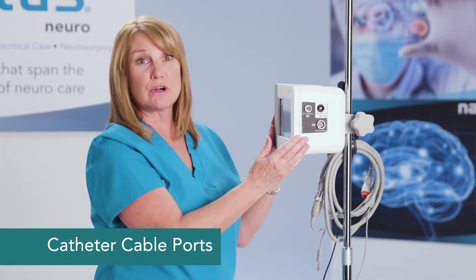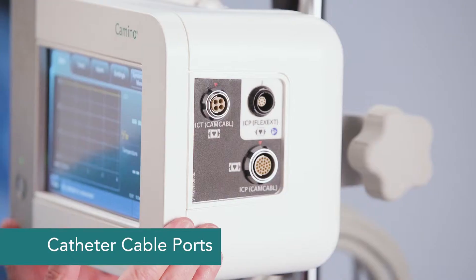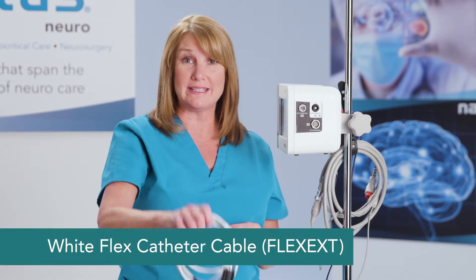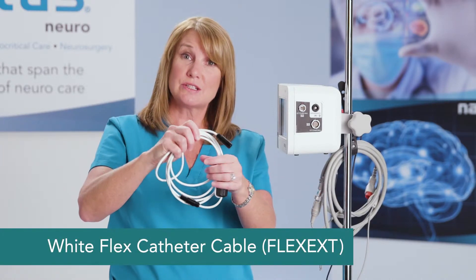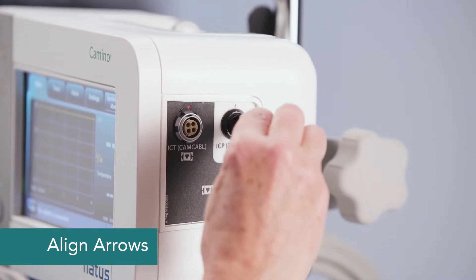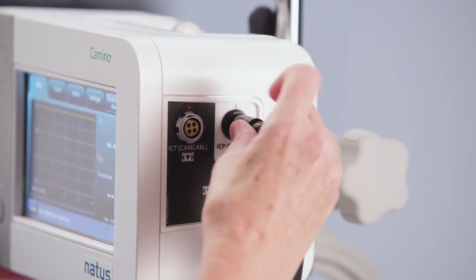Now let's look at the other side of the monitor. These ports are where the cabling is attached for the catheters. You can see there is a black area and a white area. If you're using the Camino flex catheter, you're going to want to use the white cable. To connect the white cable, line the arrows up and it simply clicks into place.